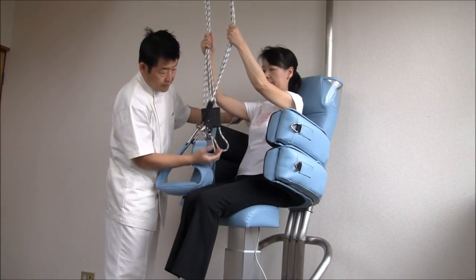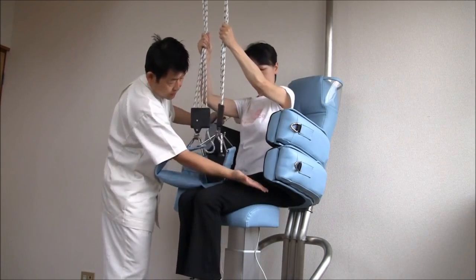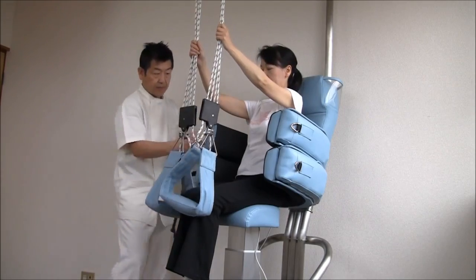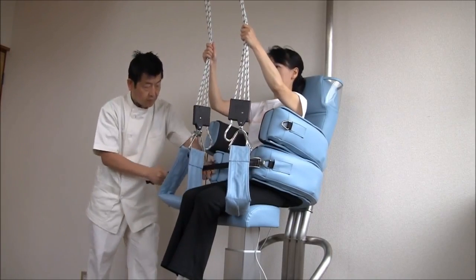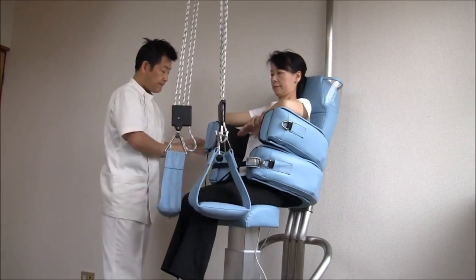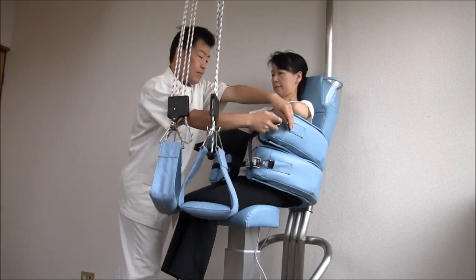The proper height is when your hand can clear between the lower arm cushion and their hip. For a patient with acute lower back pain, ask them to hold the ropes until the arm cushion is tight and closed. The upper arm cushion shouldn't be tightened too much, but the lower cushion should be tightened firmly. While the upper cushion is being closed, ask the patient to hold their arms crossed across their chest.